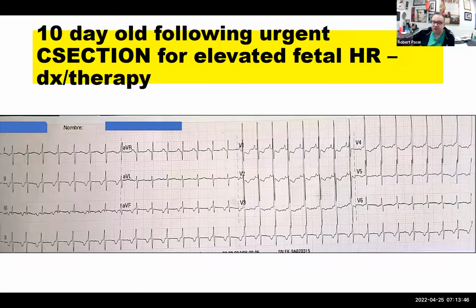And in real time, it may seem as if you never terminated tachycardia, but in fact, you may have. So it's always important, if you have a stable patient who's stable enough to get EKG leads on them, to try and run the tracing while you give the medication.